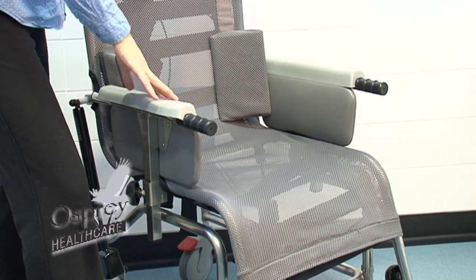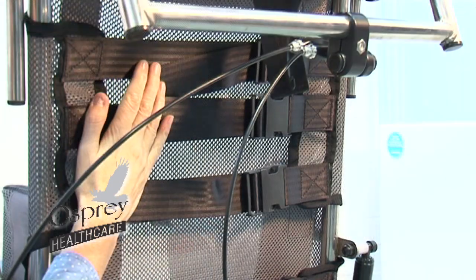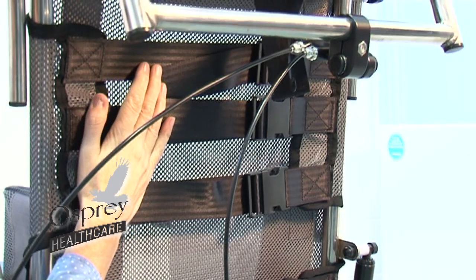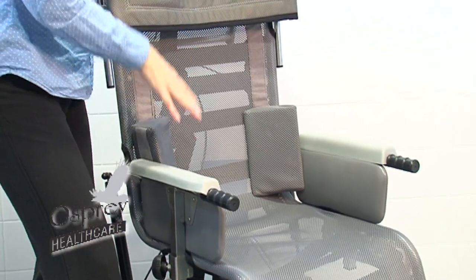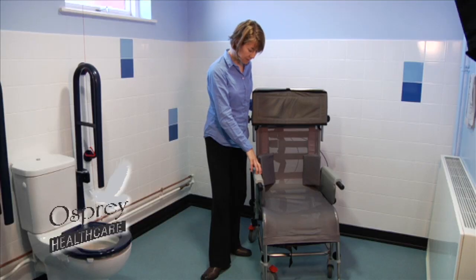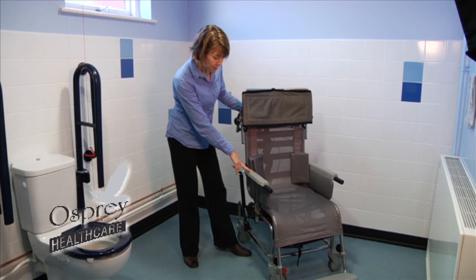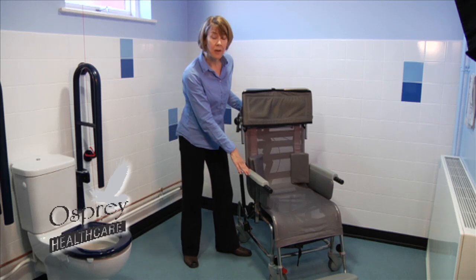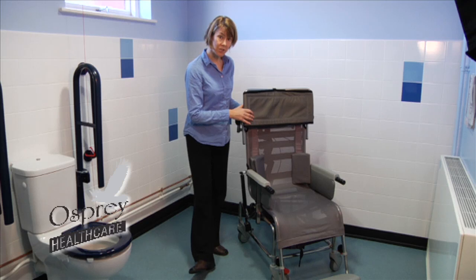The supporting surface of the shower cradle is mesh, and the mesh tension can be altered with straps underneath, so that if somebody had postural deformities or needed a particular shape to support them while they're being showered, that's achievable with this product. The frame is height adjustable, and most of the time you'd want the frame set quite low so that the tilt-in-space mechanism is easier to operate.